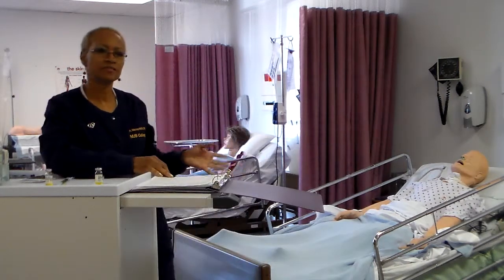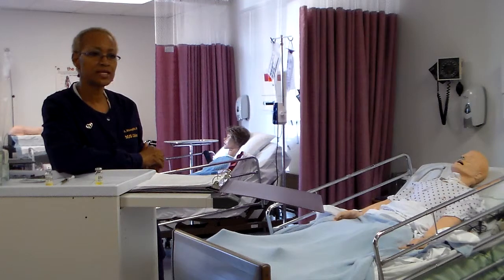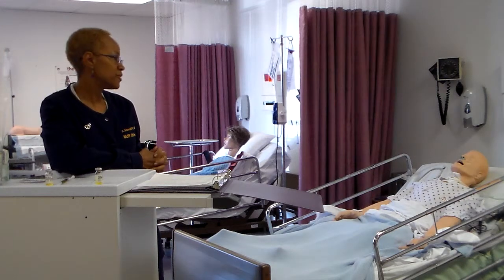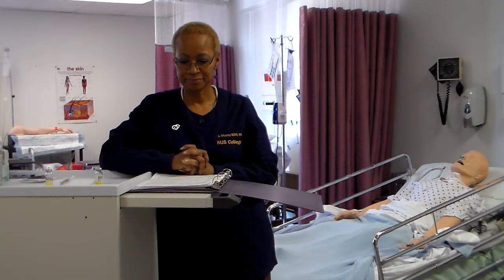I've already gone into the room. I've introduced myself to my client. I've informed him that he is going to be getting 3 injections. He is well aware of that. I've educated him on the medication, and he is aware, knowledgeable, and fine with receiving his medication at this time. No refusal. Assess for contraindications.